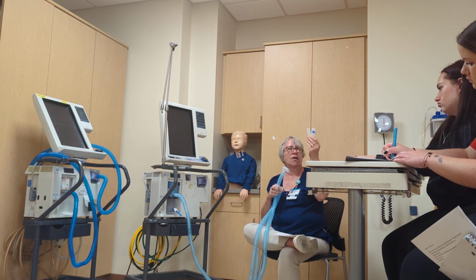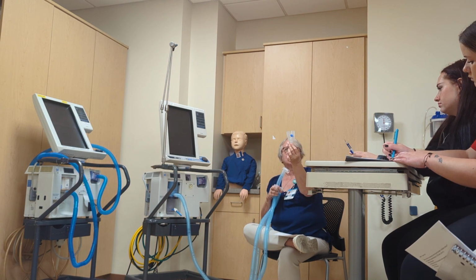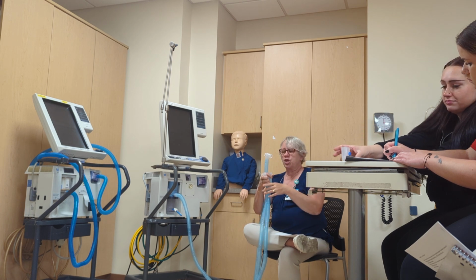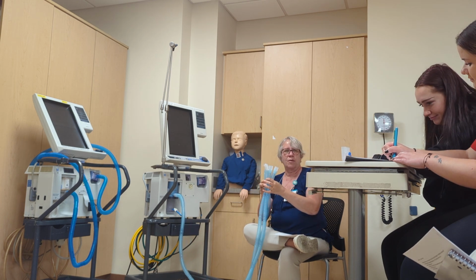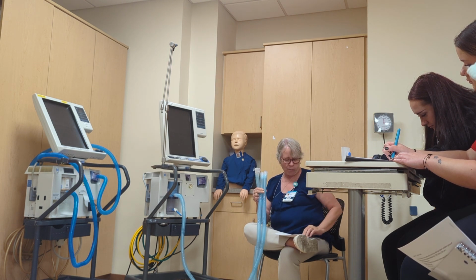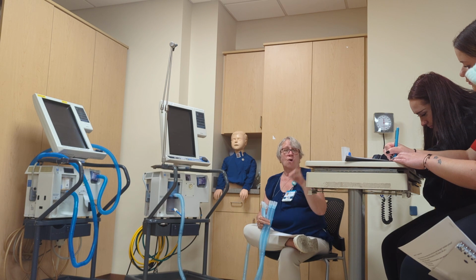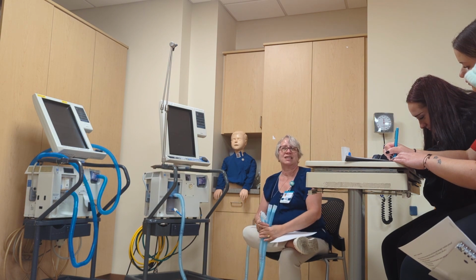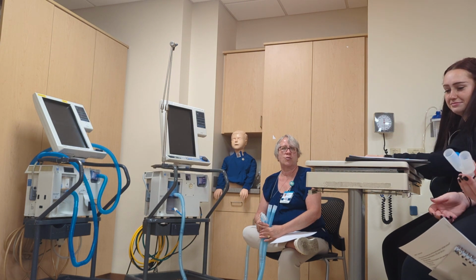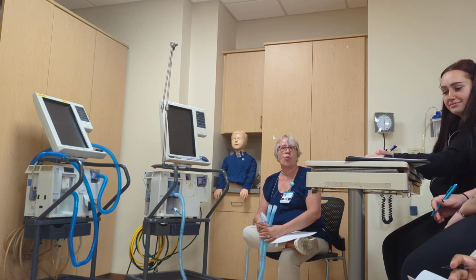Why is it called a Y? Because it looks like a Y. And that is what you will connect your inspiratory limb and your expiratory limb to, is the Y connector. Sometimes you might see it spelled W-Y-E, however you want to spell it. That's your Y connector.